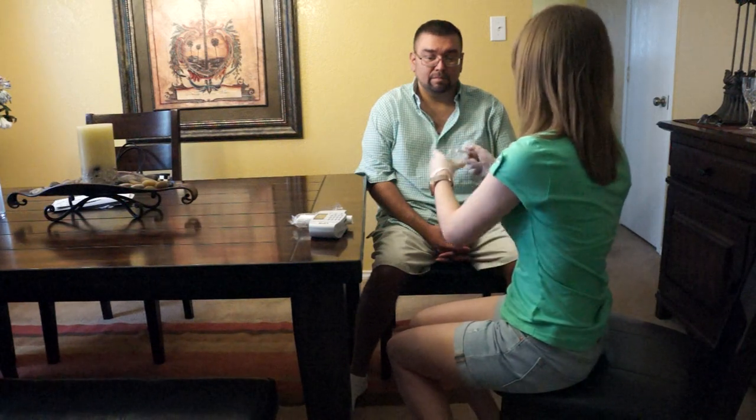Okay, now I'm going to describe the test to my subject. During each test, you always want to use these nose clips, okay? So always make sure that you put them on before we start the test. So I'll let you be in charge of that.